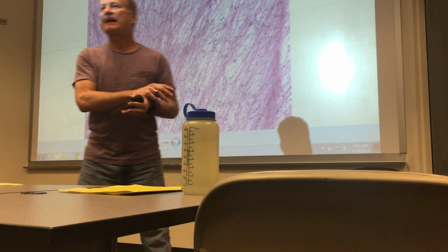As I look around the room, I see it. So this, of course, is loose connective tissue. A point to be made here is that all of the fibrous connective tissues contain all three fibers. The fibers we talk about are the predominant fibers, the fibers that are easy to see. When you think loose connective tissue, you think collagen and elastic fibers.